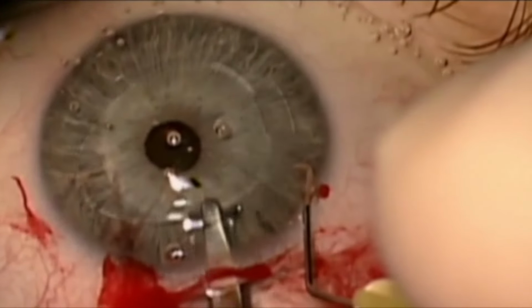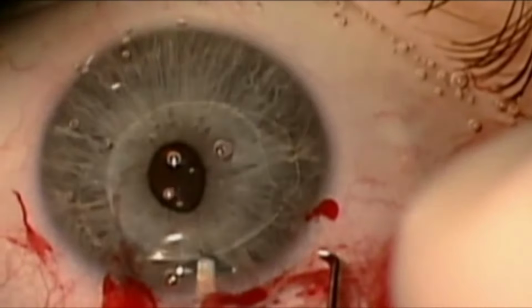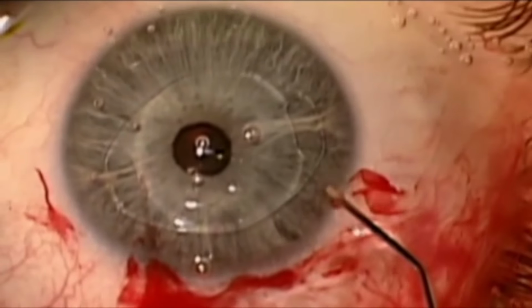An enclavation needle is then passed under the lens to catch a fold of the iris, which is then brought up through the iris claw, securing the lens into position. This process is repeated on both sides of the lens to ensure its proper fixation.